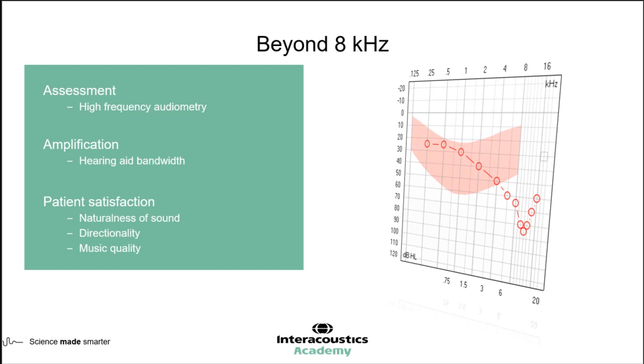I think a lot of it boils down to patient satisfaction. We know that these ultra high frequencies really contribute to the naturalness of sound, even if they aren't directly audible cues. They can really add a lot to directionality and also music quality. And those are the things that people come into a clinic complaining about, or not satisfied with. So if we can improve those areas of their amplification, then their patient satisfaction rates will hopefully increase.